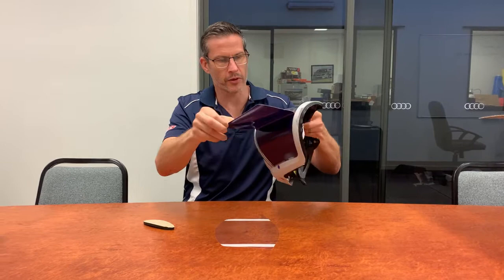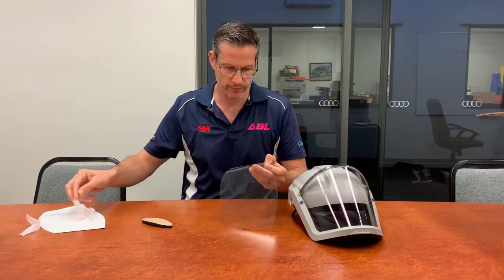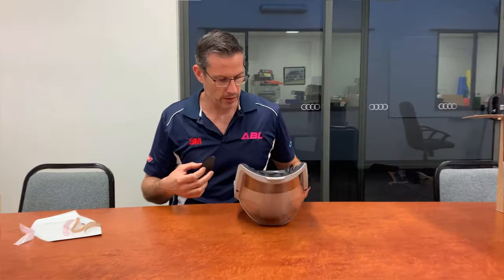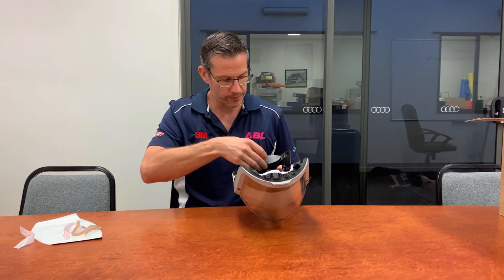A visor peel off and a head pad. First of all, remove the protective cover from the front of the Versaflow helmet. Remove the adhesive strips from the tear off, place the tear off on the front of the helmet, and then place the head pad on the back of the helmet.